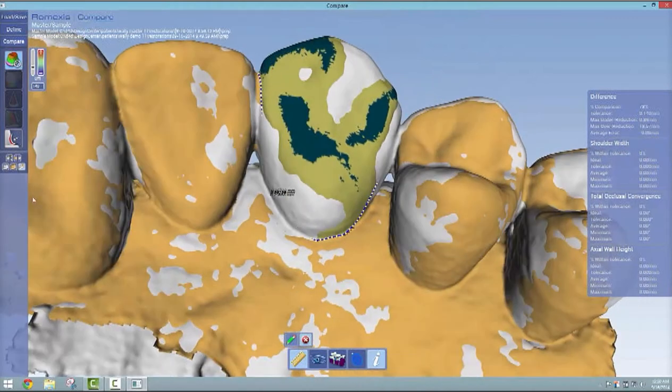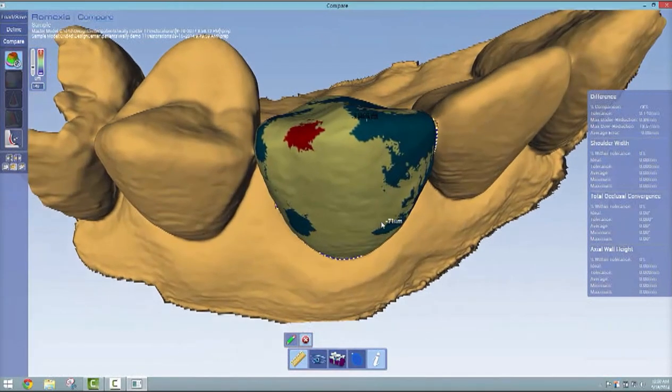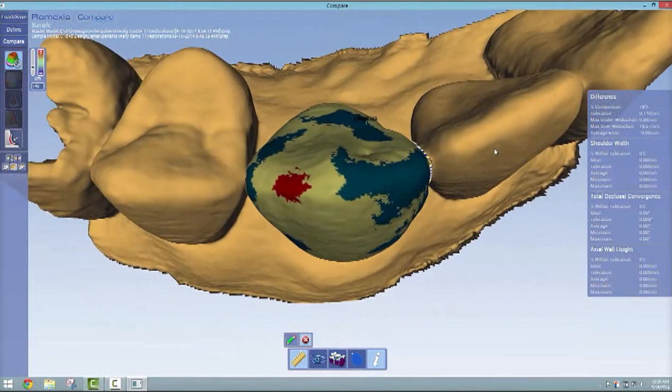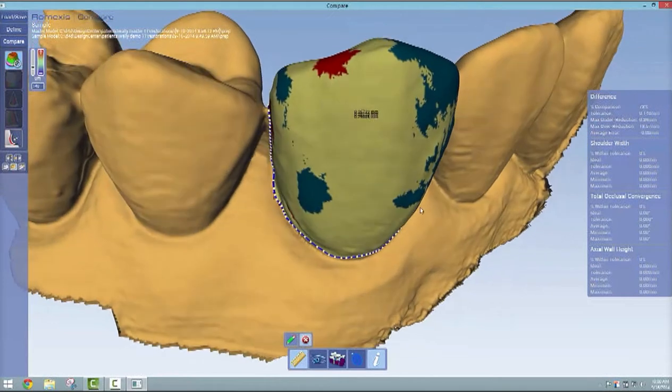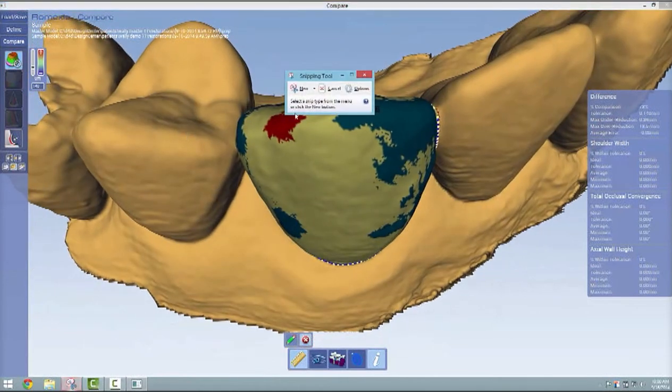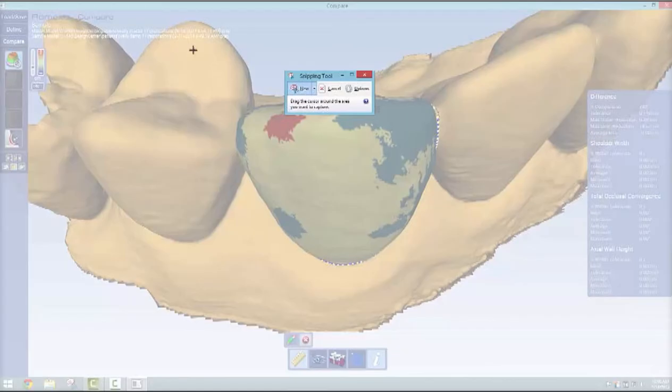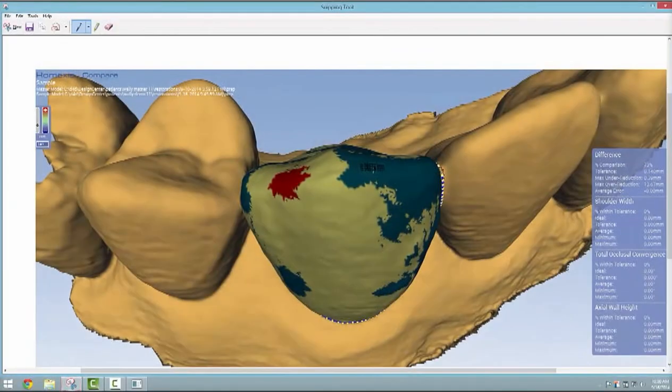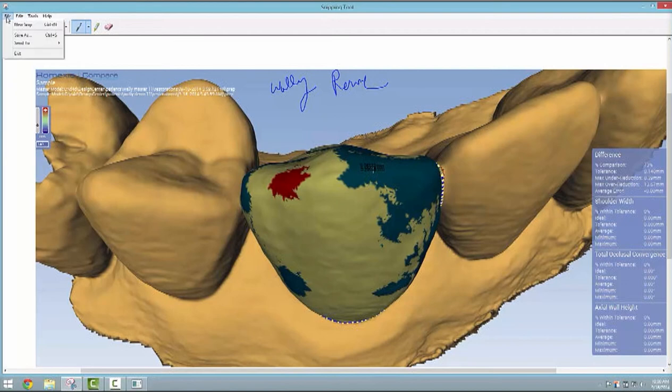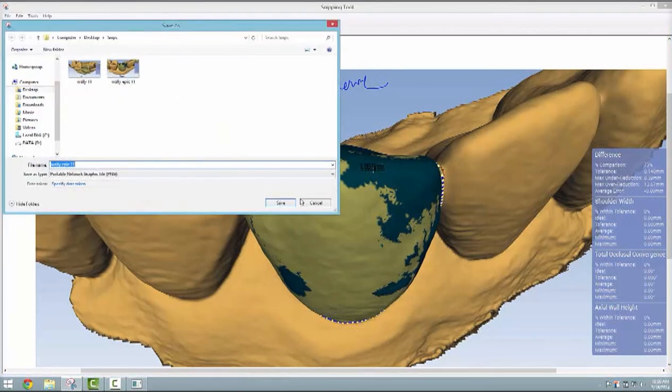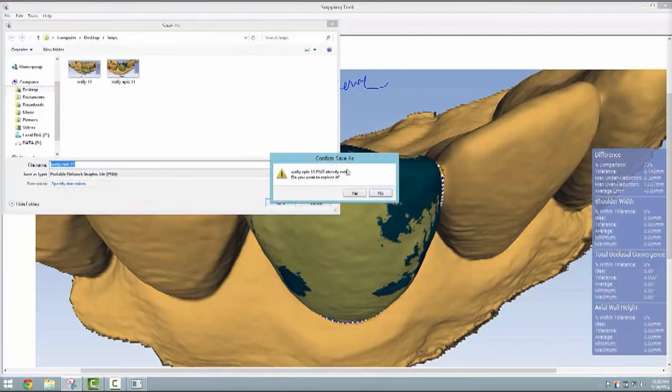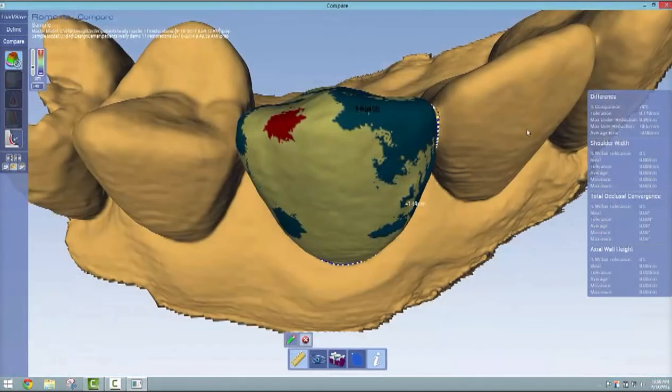For purposes of taking a screen capture, you can hit the snippet tool, hit new, and just circumscribe everything. Make sure you get your metrics or numbers there on the right, write your name, then save that file in a folder called snips on your desktop. You can print that later to turn it in.